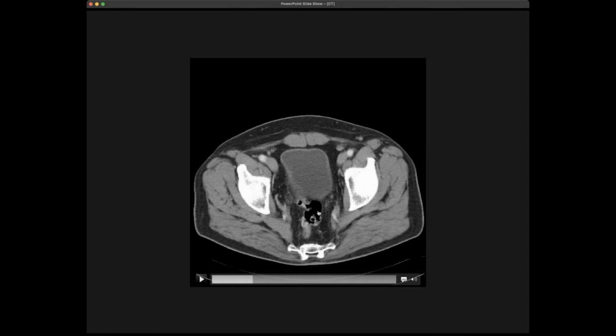But obviously this is gas inside the bowels. So you can see, even if you don't know anatomy, what I expect from you is to know why is one thing bright and what type of tissue would correspond to it? And why is it black? And why can it correspond to this? So this way you can nicely see this through.